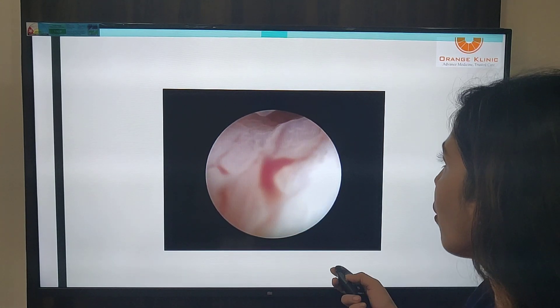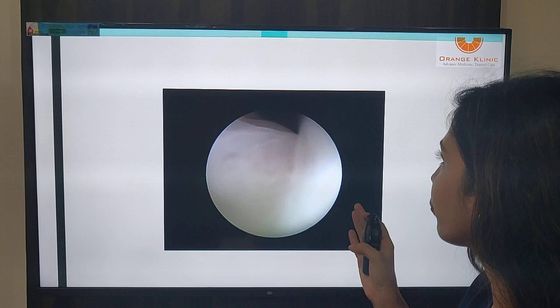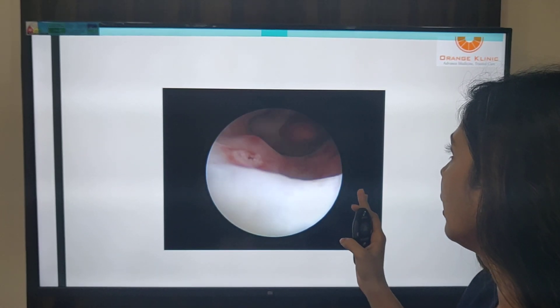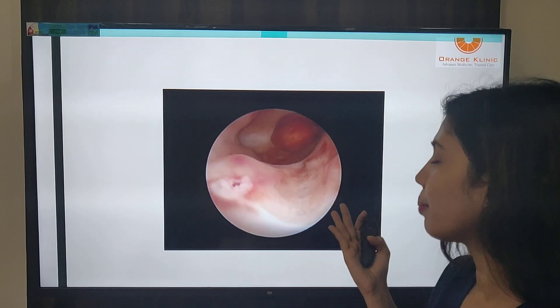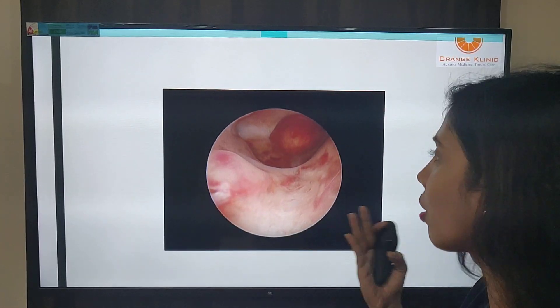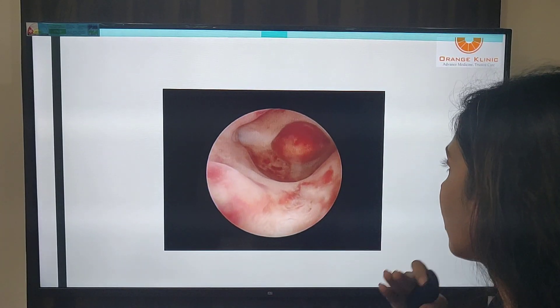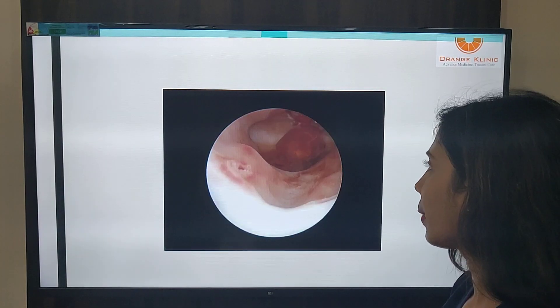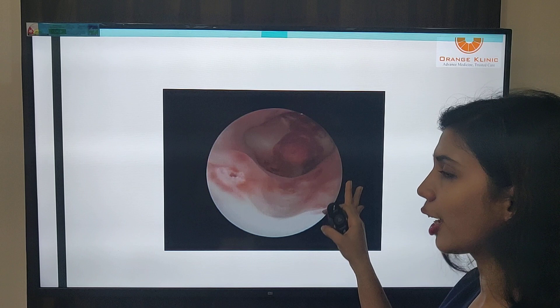Here is another video showing a beautiful view as you move inside the cervical canal. This must be a multiparous patient because we did not encounter any difficulty during negotiation of the isthmus. We can see a polyp, because of which everything is inflamed and the endometrial cavity is very irregular.